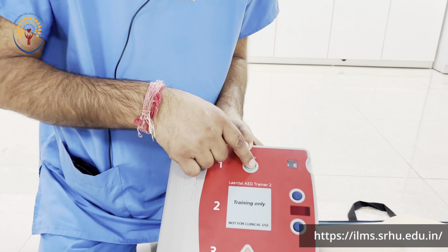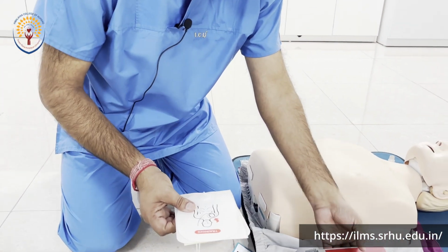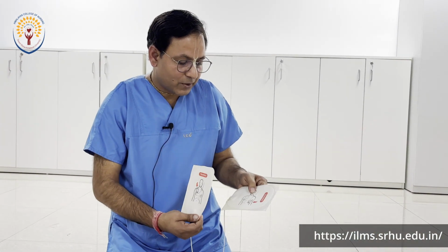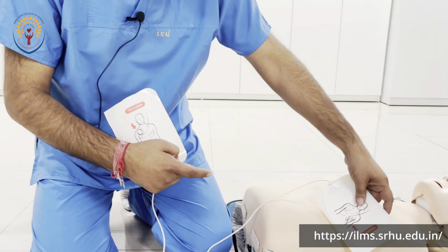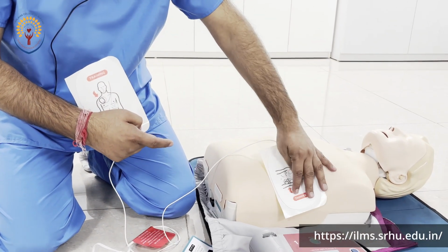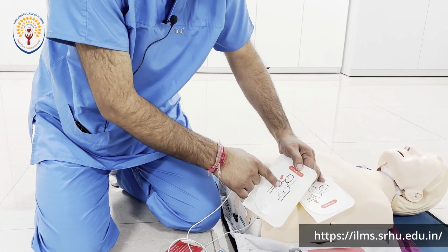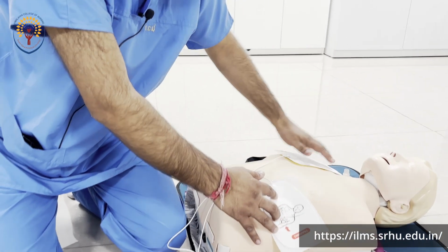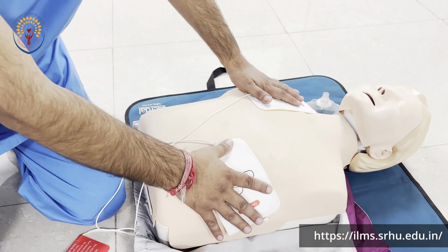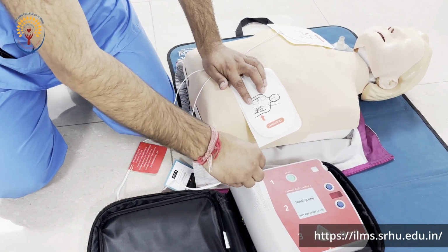After turning it on, it will say apply pads to the bare chest of the patient. There are two pads. One pad indicates that you apply it on the 5th to 6th intercostal space on the anterior axillary line on the left side of the patient, and on the other pad, the indication is that it has to be applied on the clavicle side, the right side of the patient's chest. After we apply these, it will say connect to the AED.